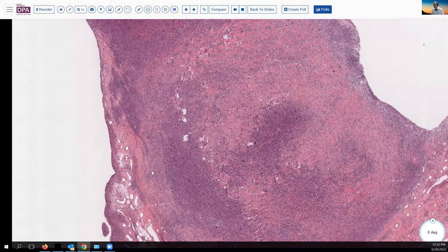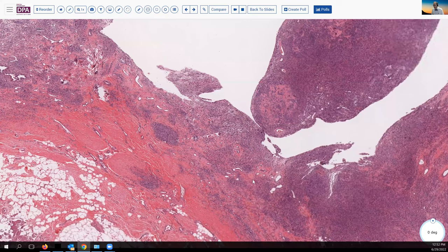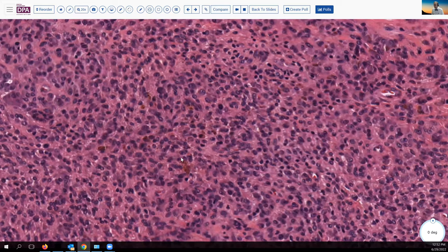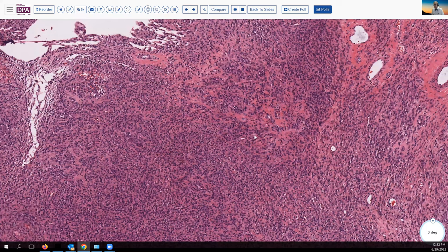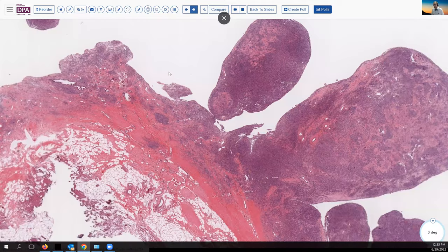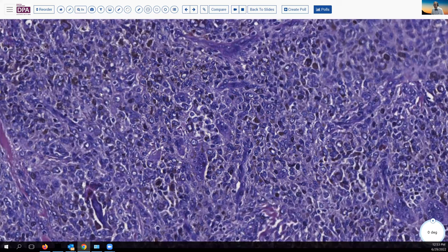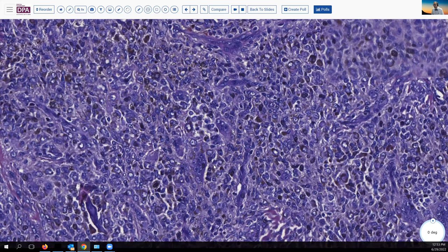Here you can see some of the nice hemosiderin deposition that gave this lesion its commonly used name, pigmented villonodular synovitis. In fact, this is not an inflammatory lesion; this is a clonal benign neoplastic proliferation. Here's another image with abundant hemosiderin in many of the nodular cells and the tenosynovial cells associated with this.